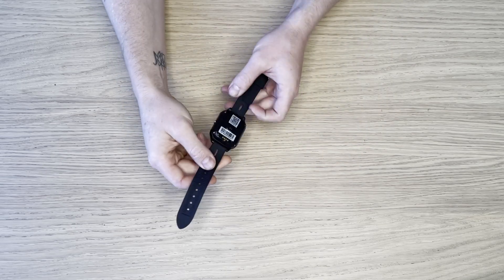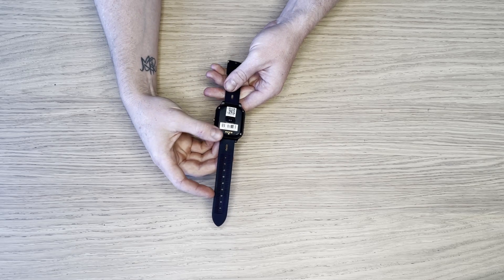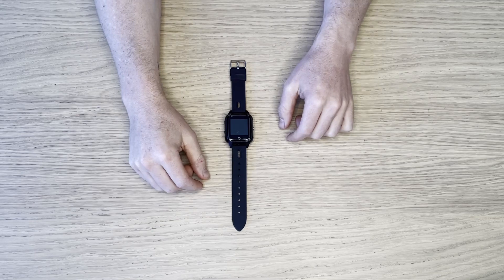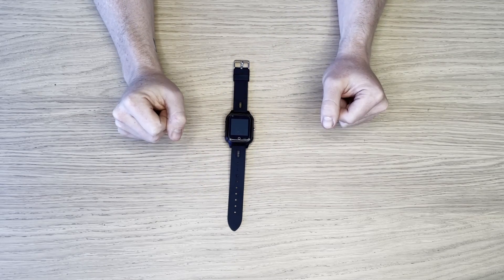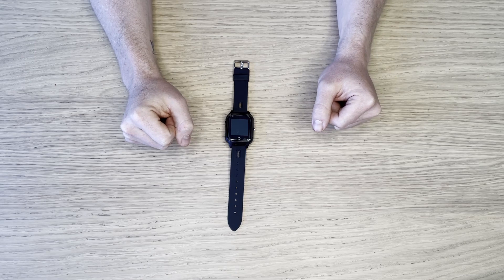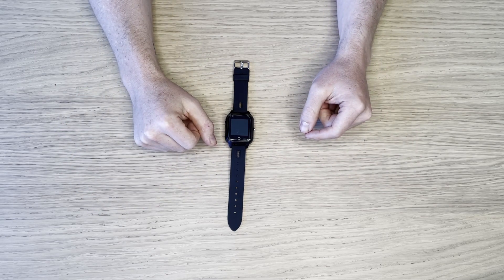We also have a heart rate sensor on the back. It's fully rechargeable with a lithium-ion battery. It runs on a regular 3G or 4G call and data SIM card. You can also set geofences on this unit, so that means you can be alerted when it goes into or out of a particular area.